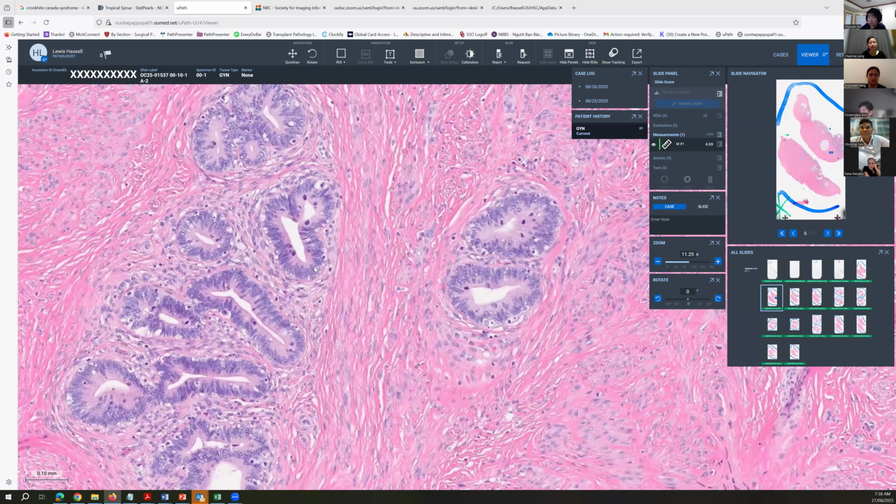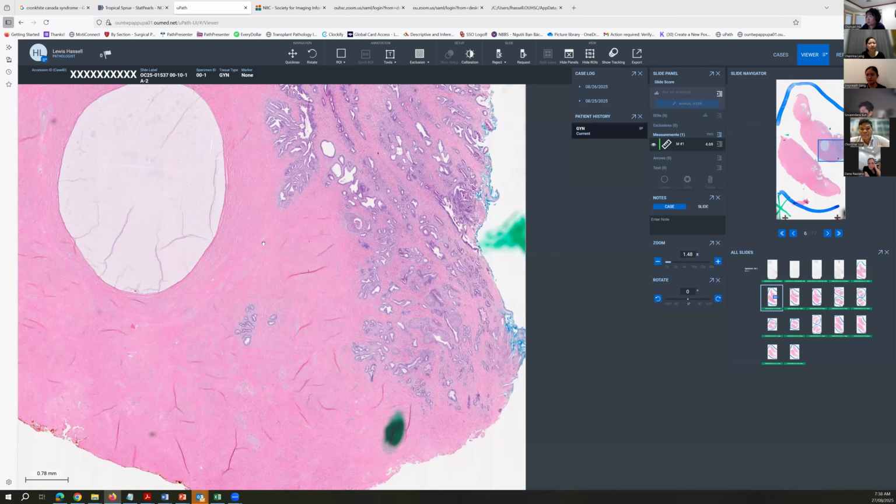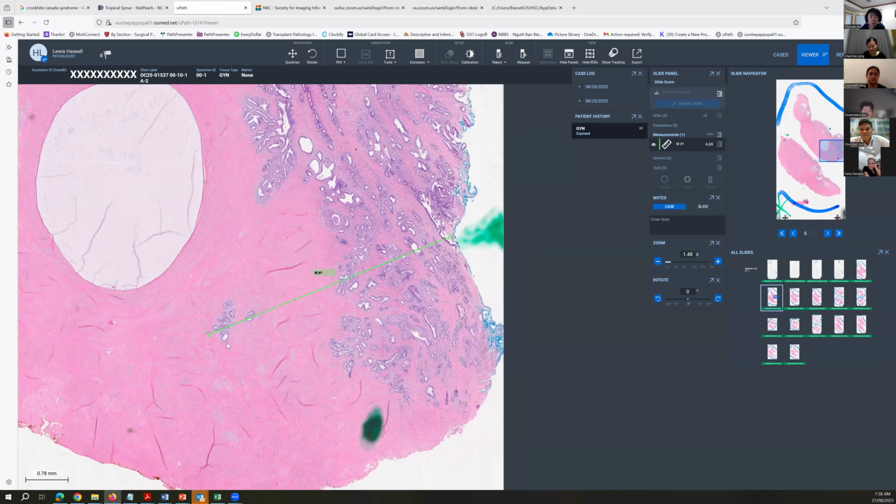So, and I don't know, maybe Esther or Padnini have other experience, but I find it very difficult oftentimes to decide, is this invasive or is this still in situ disease? So oftentimes we will just give a total thickness of the lesion, which is kind of what I did here, just to measure the total thickness. And that will help the clinician decide, do I need to do a simple hysterectomy or a radical hysterectomy based on this depth of extension?